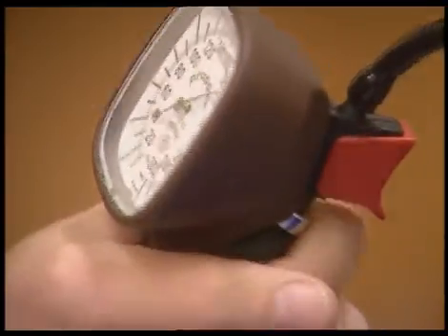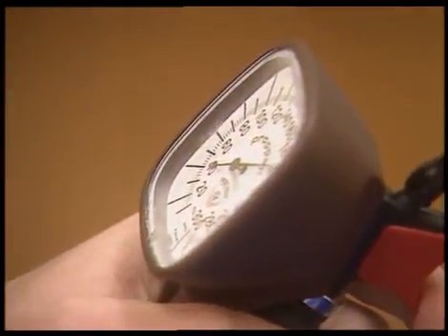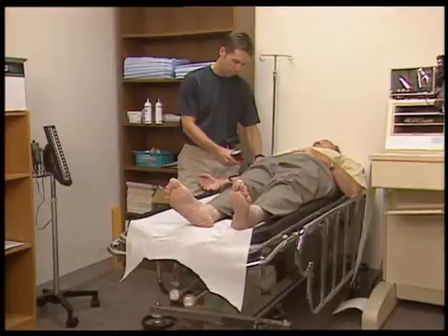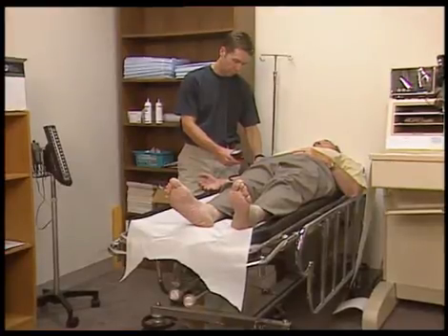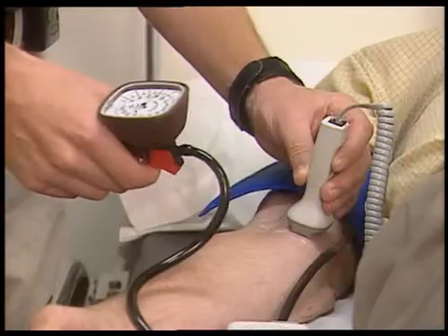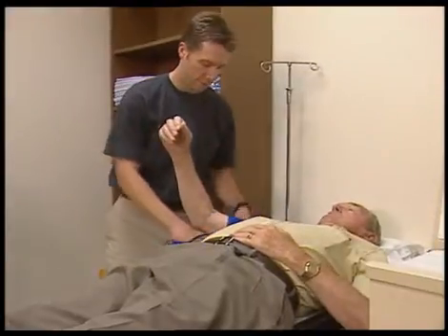Inflate the cuff approximately 20 millimeters above the point where the sounds disappear and then slowly, about 2 millimeters per second, deflate the cuff until the sounds reappear. Record this pressure and deflate the cuff to zero. Now repeat the process for the other arm.